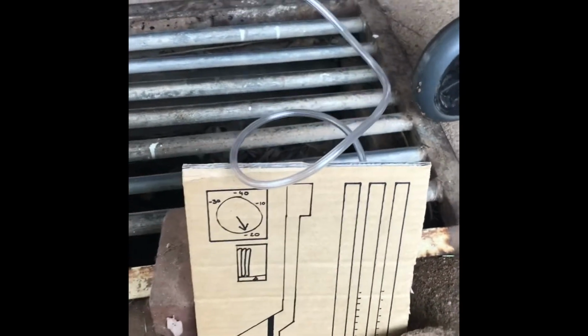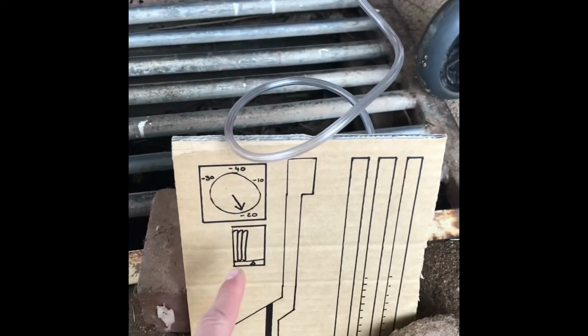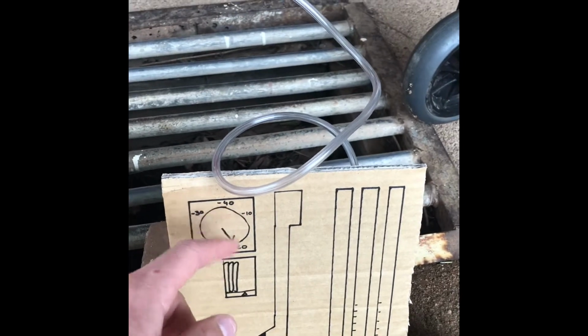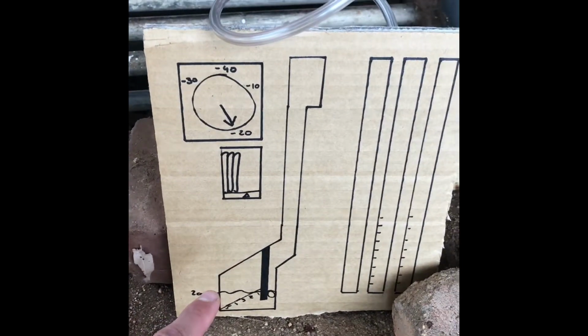Now we'll discuss the ongoing observations for the underwater seal drain during the transport. So if suction is required, we're going to have the suction hooked up. We're going to have the suction turned on until the suction bellow reaches the triangle, and the suction can be adjusted on the side with this dial to whatever has been required. We're going to make sure that the sterile water in the chamber is at the 2 centimetre line.